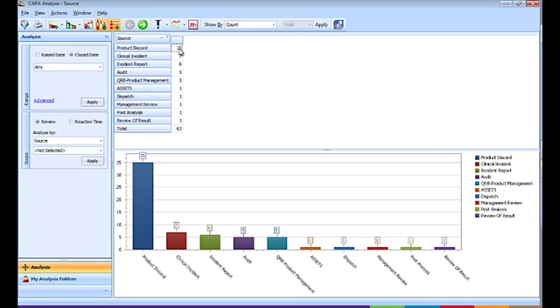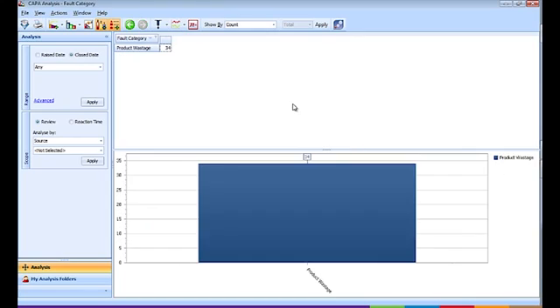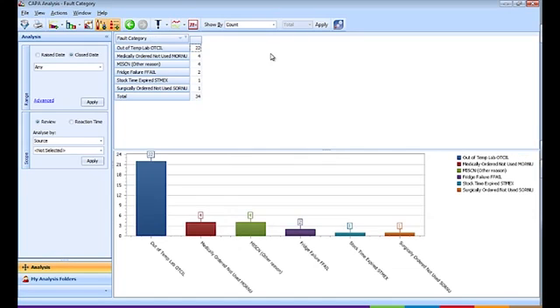If we click back, then we can start drilling down into fault categories. You can see that we have an overarching parent of product wastage, but this can be further drilled into. You can see that the defined categories are pulling through, and out of temperature lab environment is the top offender.